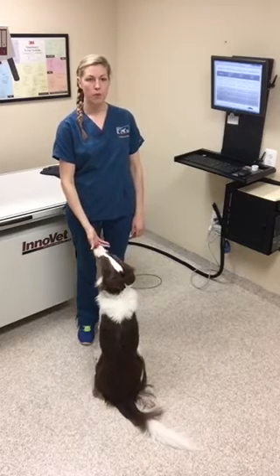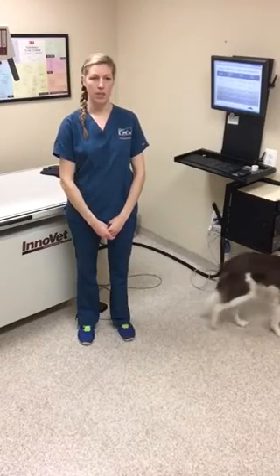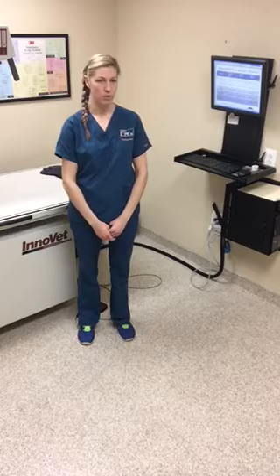It is an essential component for obtaining diagnostic quality images in a consistent way, as well as limiting waste and increasing safety by reducing repeated exposures.